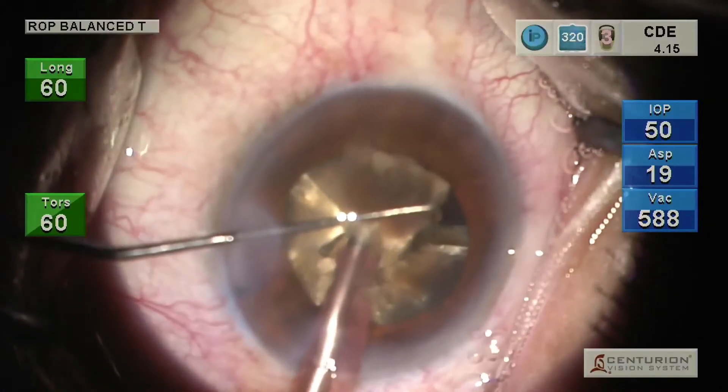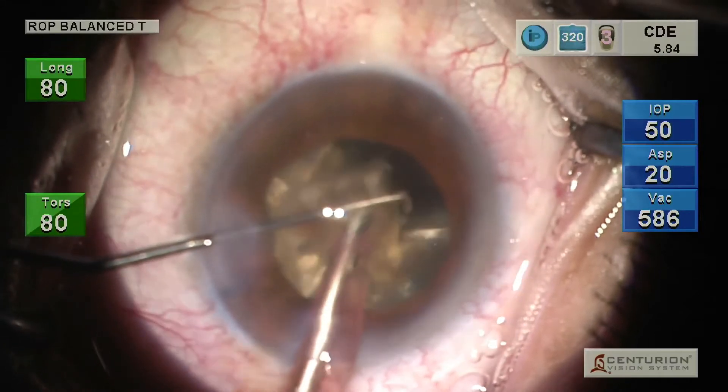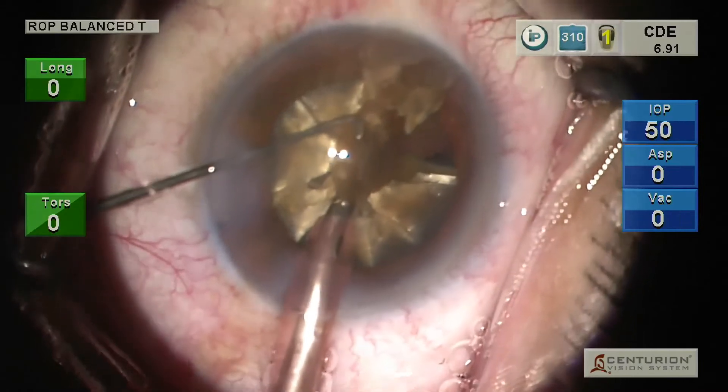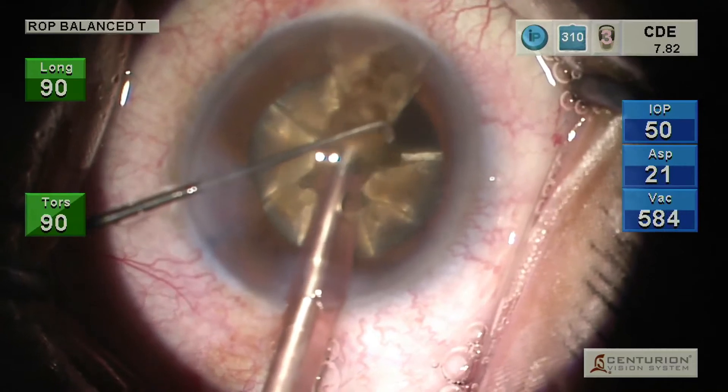This is a surgical video demonstrating the chopper shield method to prevent mechanical damage to the corneal endothelium. A side port incision is fashioned 60 to 80 degrees from the main incision to provide optimum chopper maneuverability.